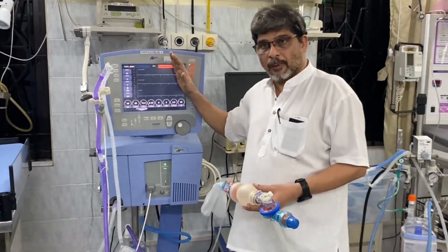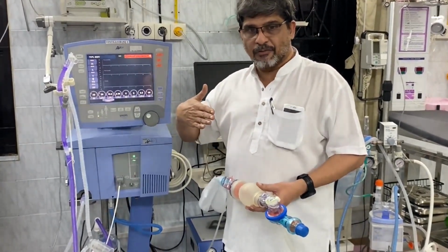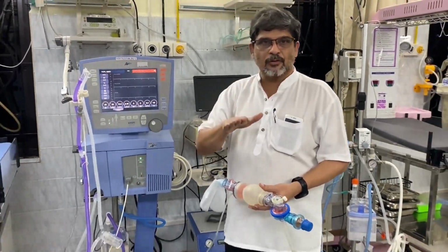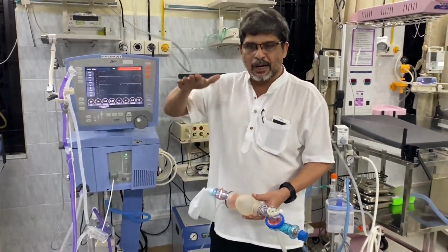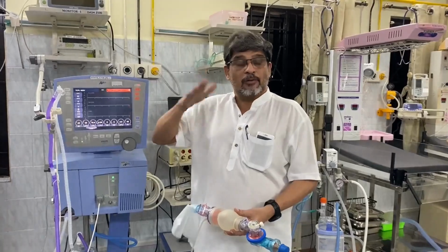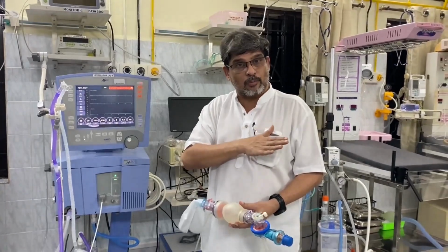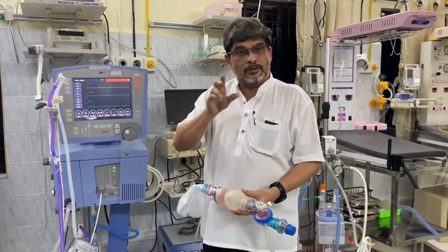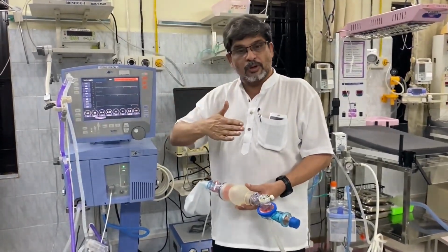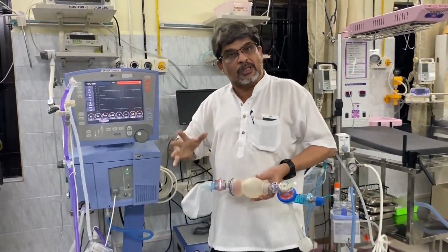Monitors may fool you. So if I take a deep breath, my chest bulges. If I breathe out, my chest goes in. So you look at the chest of the baby or the patient. If the chest is rising as a normal person breathes, then you have done a good job. Then once it has risen, it falls back as it would have in a normal patient. That should be your positive end-expiratory pressure. You can't have an expanded chest, not allow it to collapse, and then keep on expanding. The air will keep on accumulating, the lung will burst and you get pneumothorax.